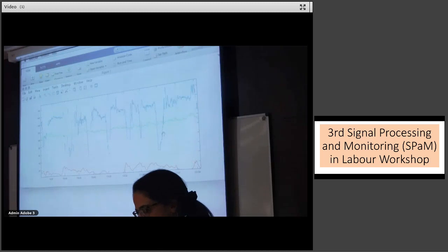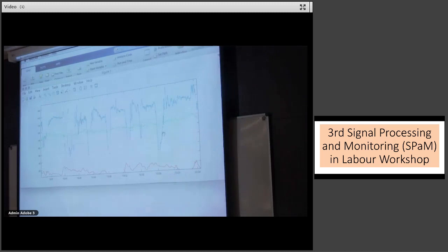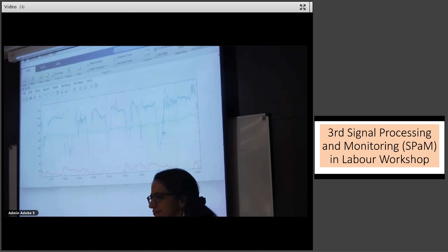We, as clinicians, have made that error for decades because we've been told that decelerations that occur after contractions are a problem for the baby. What I'm saying is that's just the morphological appearance of those decelerations. The genuine late decelerations will not dive down and dive up quite quickly. They come as U-shaped, and you're not going to get it on this contraction, and then it skips the next contraction, because the gas transfer doesn't change at the placenta.